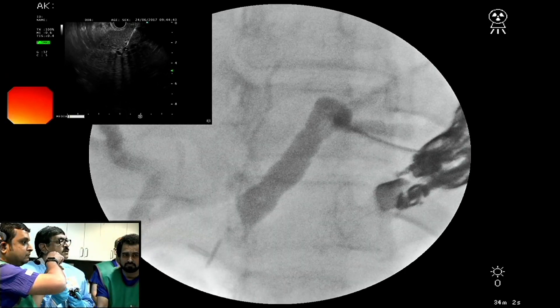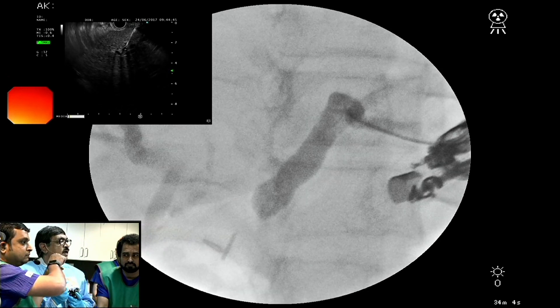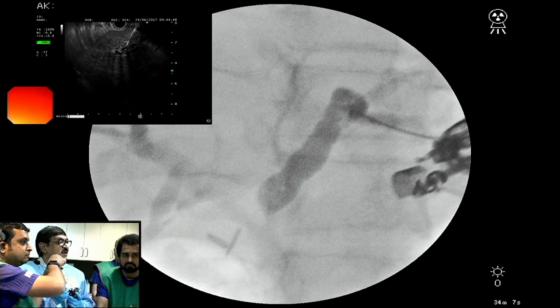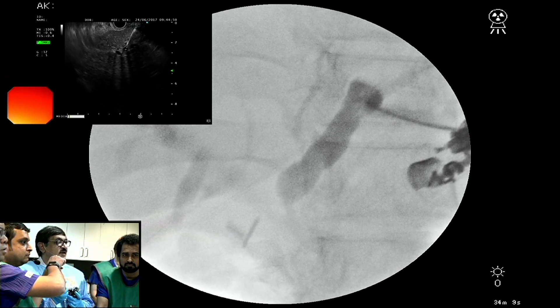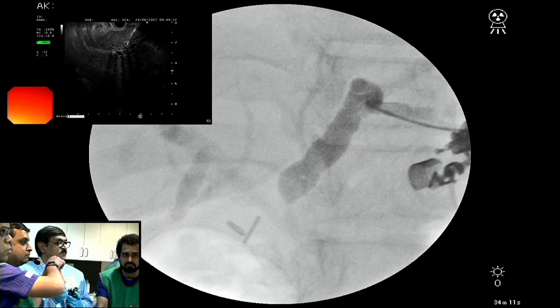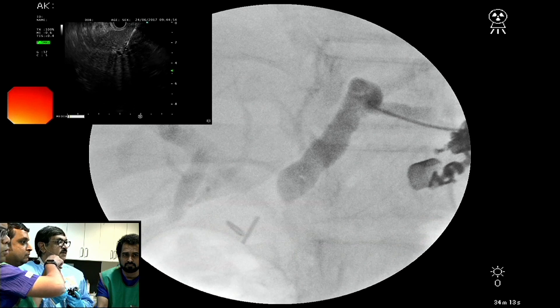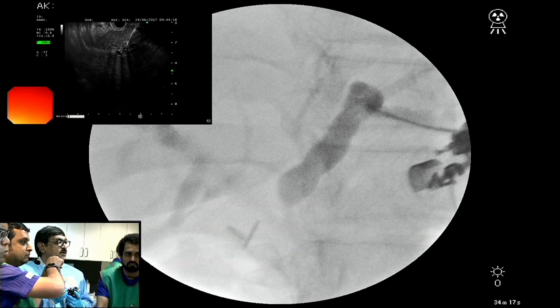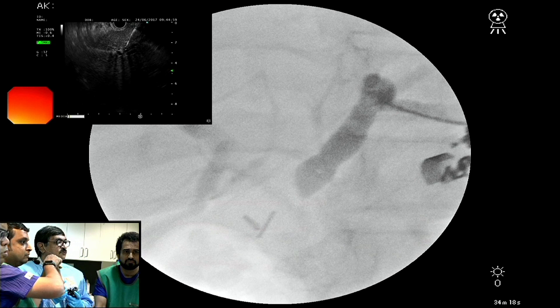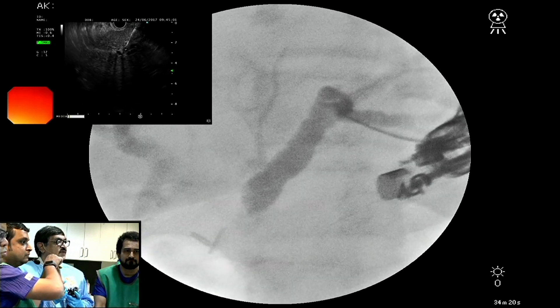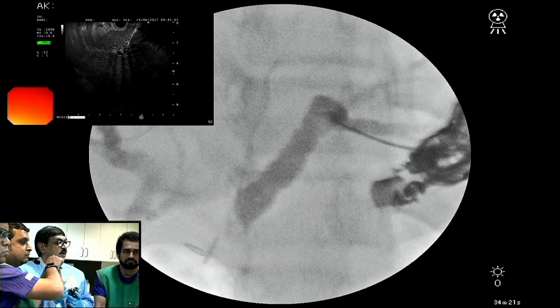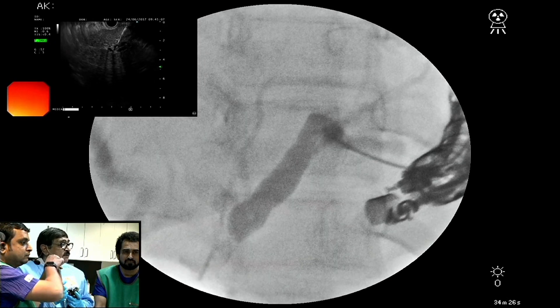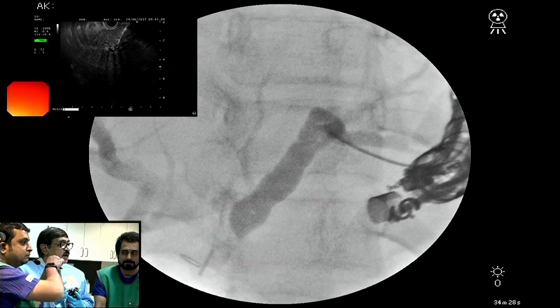What kind of guide wires are you using here? This is our favorite — 260 centimeters, curved Terumo. We use this for both ERCP and EUS and find it useful, because you see the tip movements can be done very freely, and torque can be applied so that we can rotate it in a desired direction.